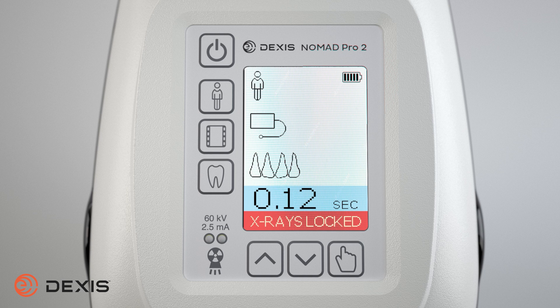By pressing the image receptor button, you can select film, phosphor plate, or digital sensor. As you press the button, it toggles through the receptor types and auto-adjusts the exposure time accordingly.